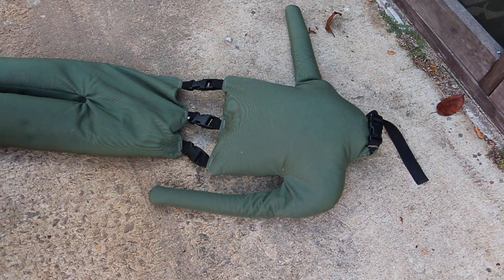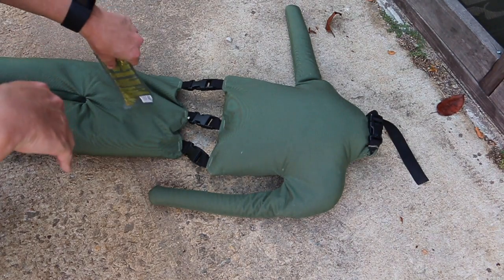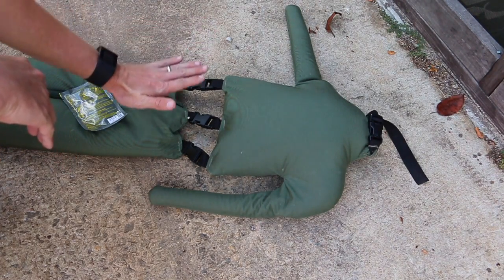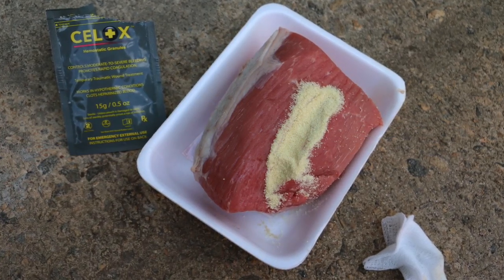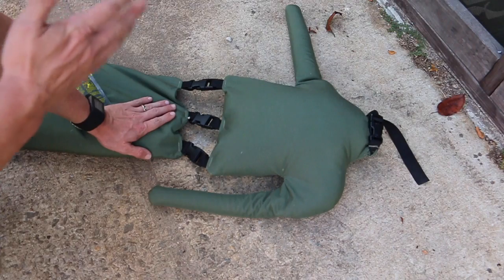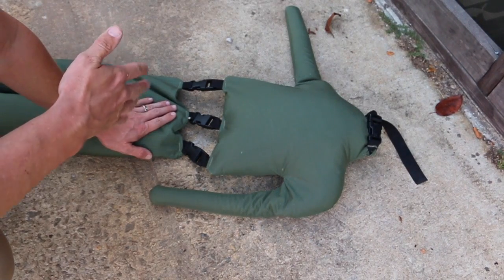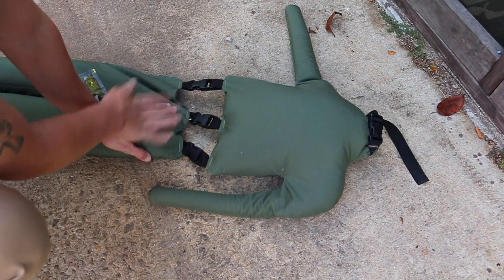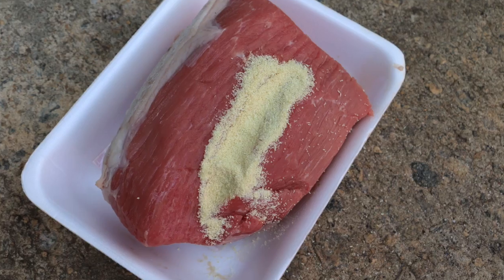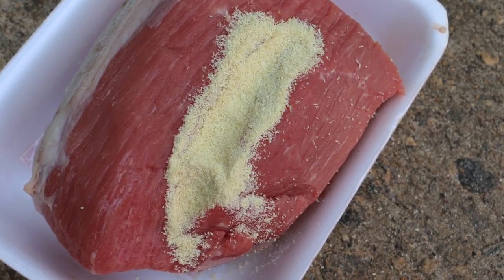For this Silox, you would pour this down the wound and put pressure — a lot of direct pressure. You can use gauze if you need to as well. Just regular gauze would work, and you're going to hold pressure for about three to five minutes — firm pressure, like you put all of your body weight onto this injury. Silox says their product works better than combat gauze on patients who are on blood thinners or have a clotting disorder. That's coming straight from them, but they do say it works better.